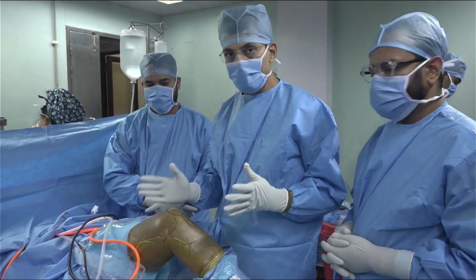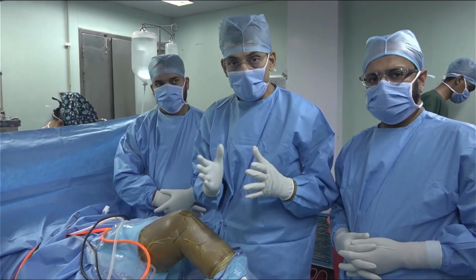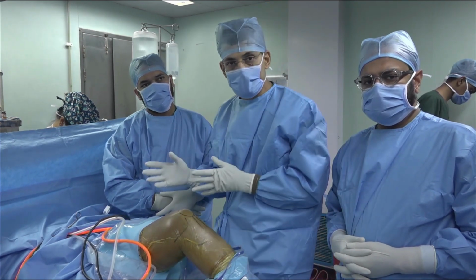So on the femur, we will be using the EndoButton Flex, which is a hybrid loop button. The button is an intermediate between a fixed loop button and an adjustable loop button.